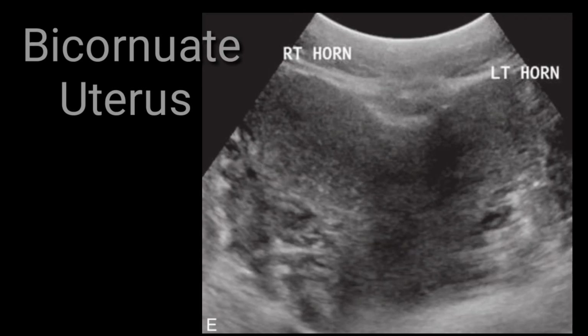In bicornuate uterus, usually these horns sometimes unite together before the cervix. In that case, this would be considered a bicornuate unicollis. But if these both horns are separated until the cervical region and the cervix is also separated, then it would be called a bicornuate bicollis. But in this case, this is bicornuate unicollis because the cervix is one and only two horns are visible. It's very easy to pick on ultrasound imaging.